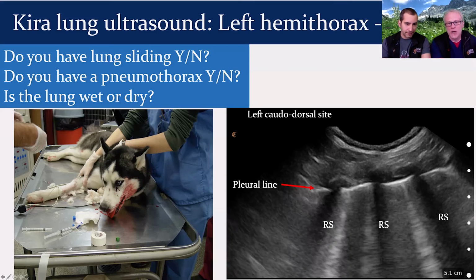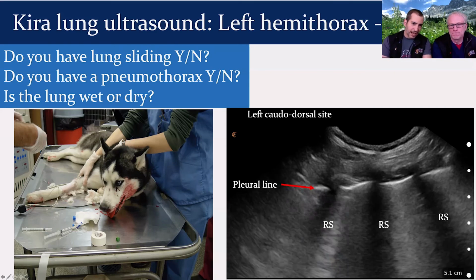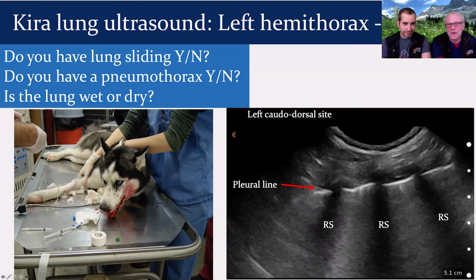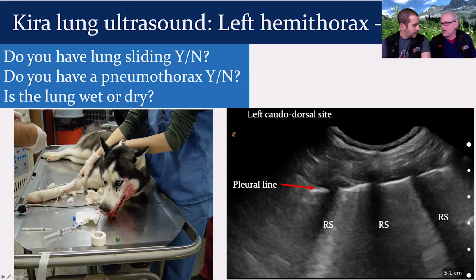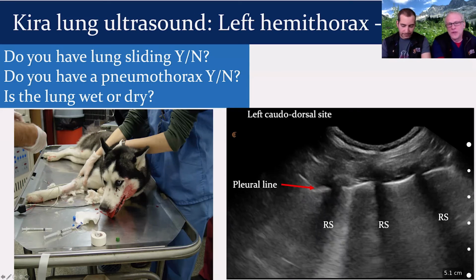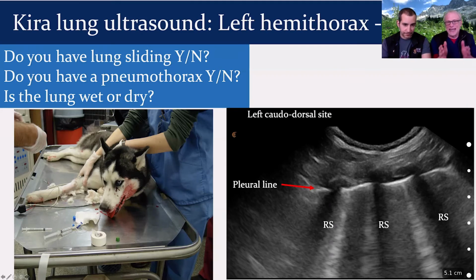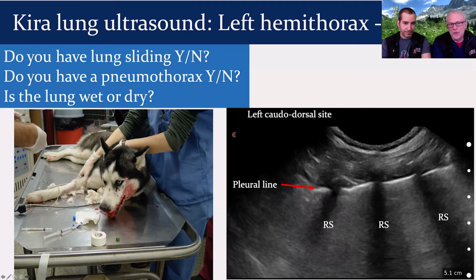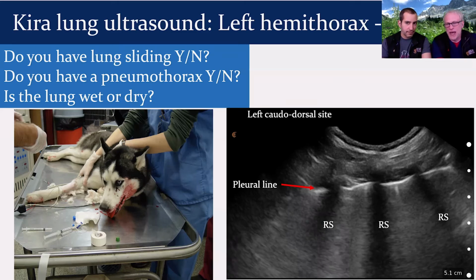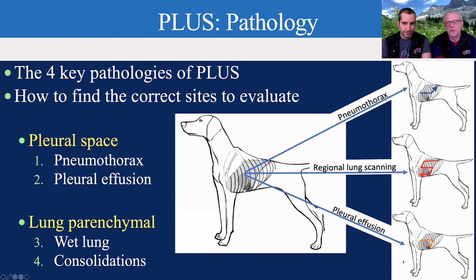And Dr. Chalhoub, my next question then, since you said you saw B lines, how many do you see in this ultrasound image here? Probably a bazillion gillion. Zillion. All right, so we got an increased number of B-lines. We've got at least probably 10 here across this entire window. And we like to say that number of B-lines not between rib spaces because our animals are such different sizes, between a Great Dane and a kitten, for example. So we like to count them across the entire window. Do you have more than 3? Yes, this by definition is pathologic increased B-lines. We have pathology in the lung, which is being interpreted at the lung surface.